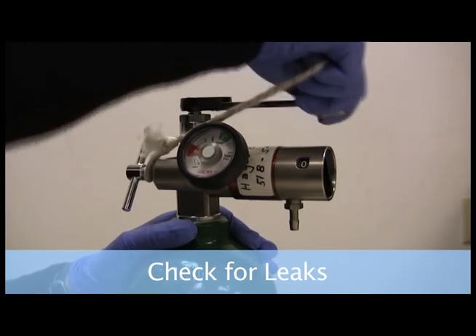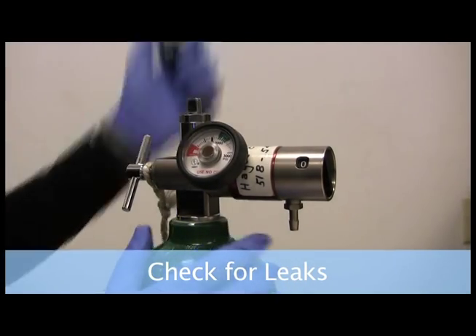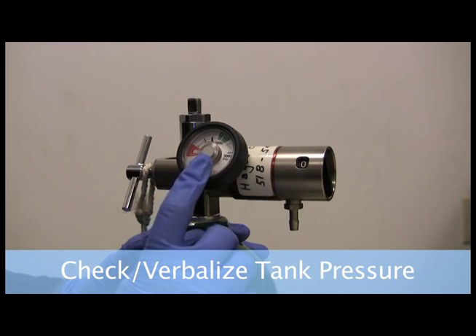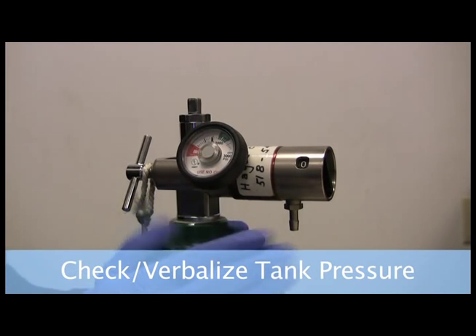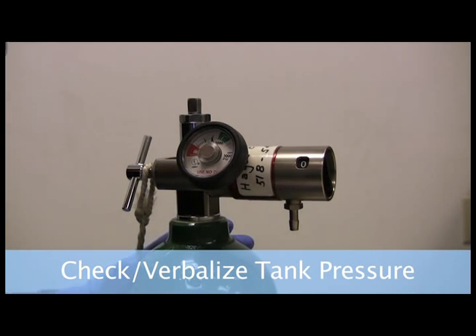And then I'm going to go back one round. Now, as you can see, we are up to, let's say, 1500 PSI. So we have enough in here. Remember, you never want to let it go below 200 PSI.